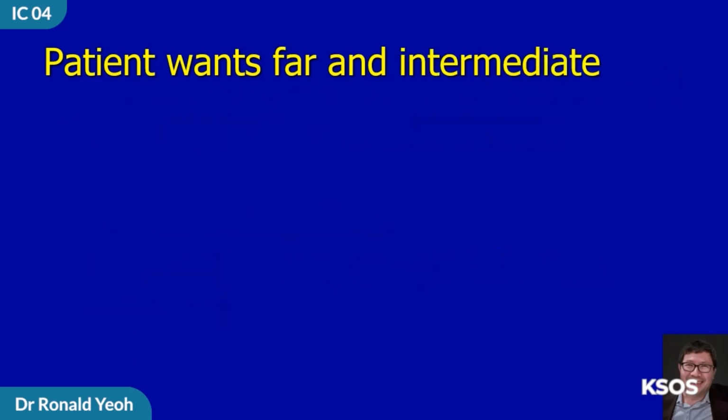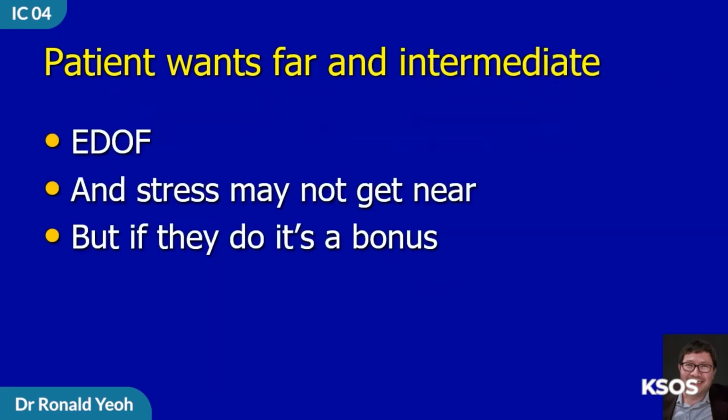Now, what if the patient wants far and intermediate? Well, that's easy as well. You just give them an EDOF, stress that they may not get near, but if they do, it's a bonus.